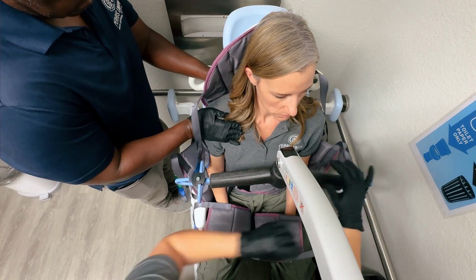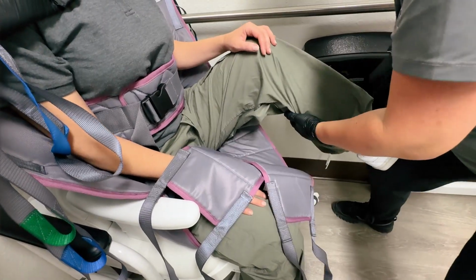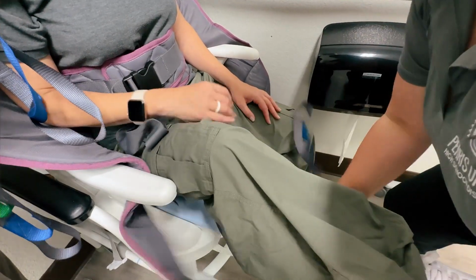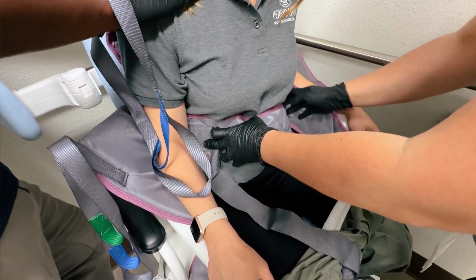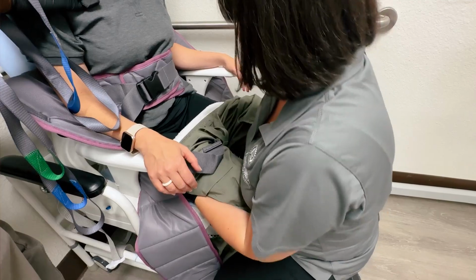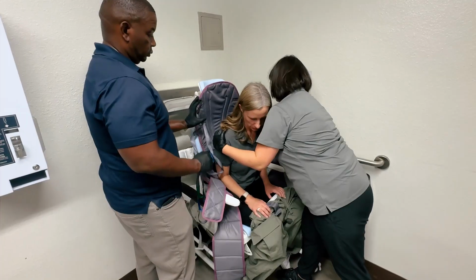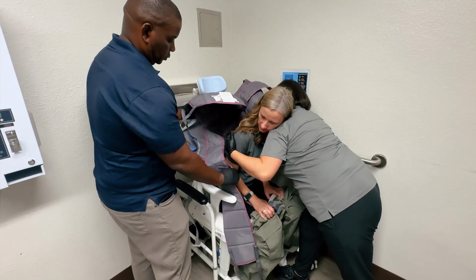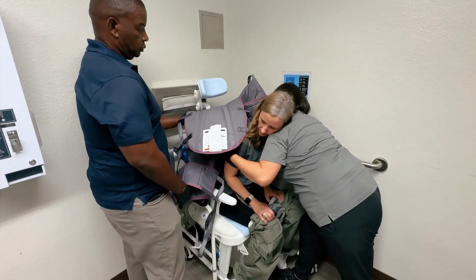When seated on the toilet, use one assistant in front and one to the back and side to support the student. Remove strap loops from the Hoyer. Remove leg straps, and then lower pants and absorbent brief further down towards the knees. Gently lean the student forward and remove toilet sling from the student. Return the student to an upright, seated position.